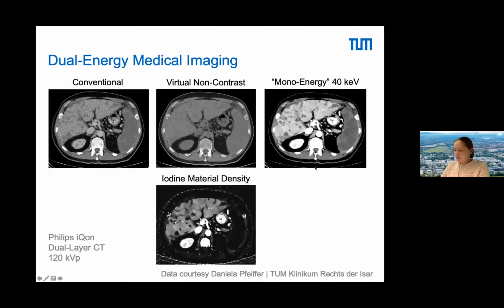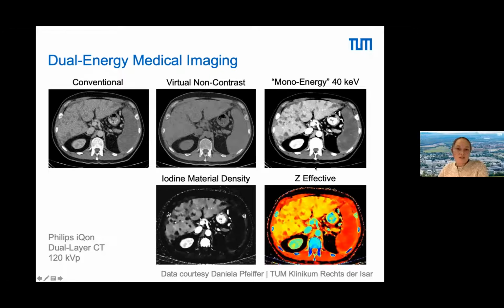And also an interesting aspect, you can calculate the Z effective distribution. So really, where did your iodine go? And this Z effective, for example, is also used for calculating radiation in oncology, like radiation plans for treatments and so on. So Z effective is now a commonly used number, the distribution for that.